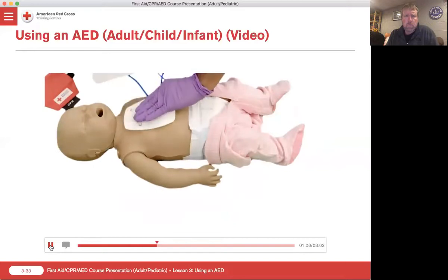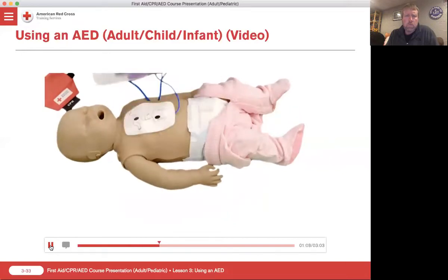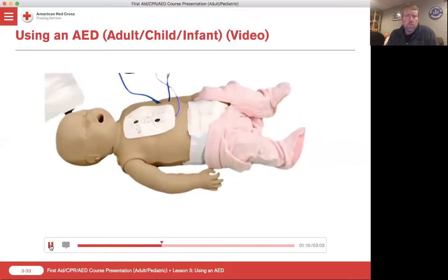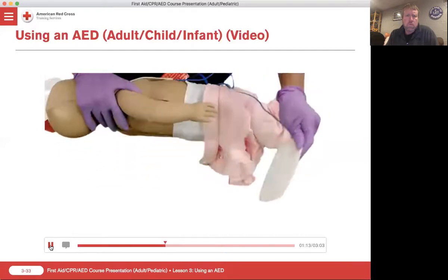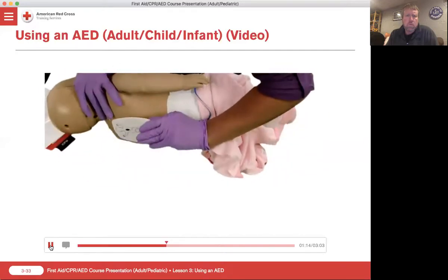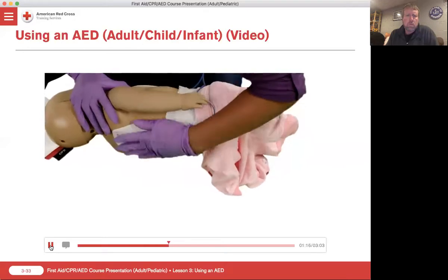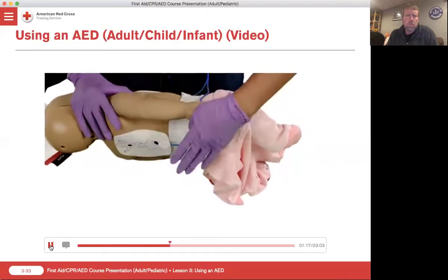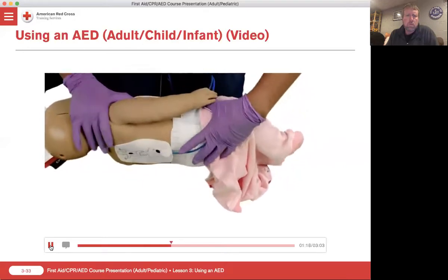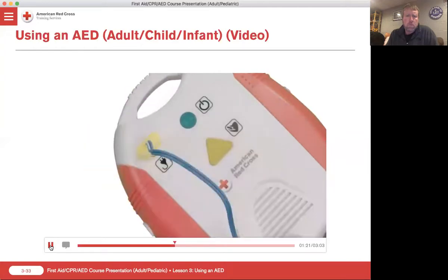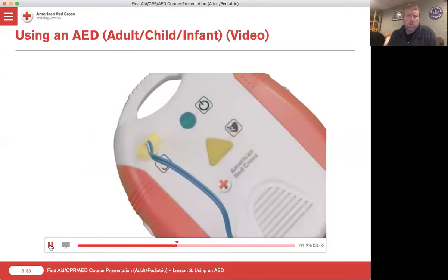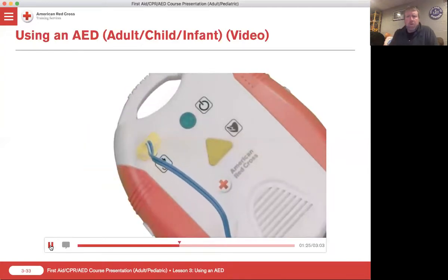If the pads touch, which is usually the case with small children and infants, place one pad in the middle of the chest and the other pad on the back between the shoulder blades. Plug the pad connector cable into the AED if necessary and prepare to let the AED analyze the heart's rhythm.